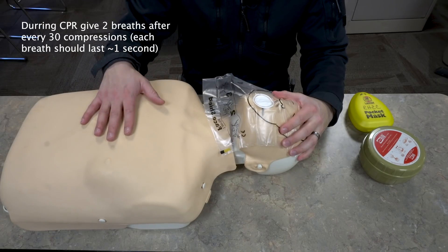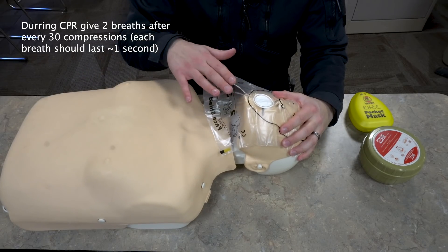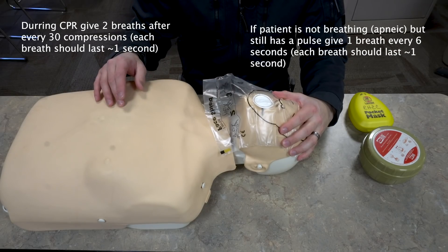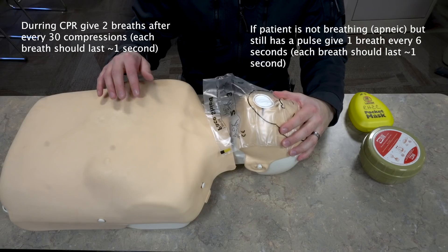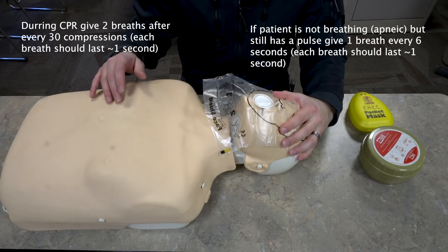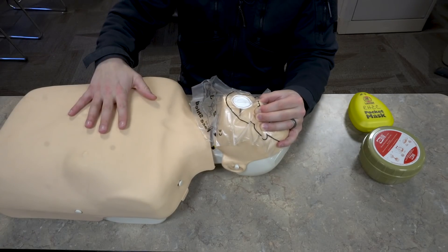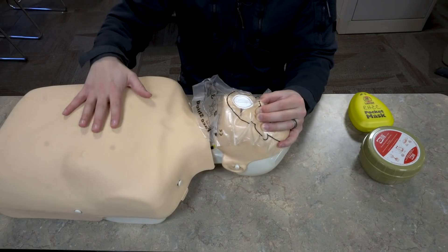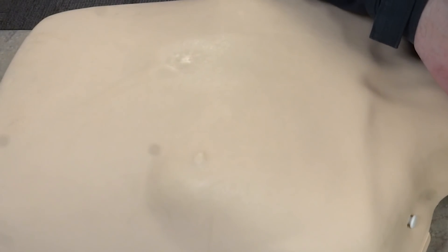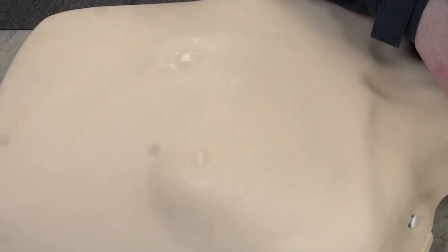If they're having CPR performed it's going to be 30 compressions, two breaths. If they're apneic we're going to give one breath every six seconds — so that would be: breath, one, two, three, four, five, six, breath. When you ventilate you just want to ventilate enough so you see chest rise. You don't want to ventilate so much that the lungs are completely expanded — you don't want to hyperinflate those lungs.